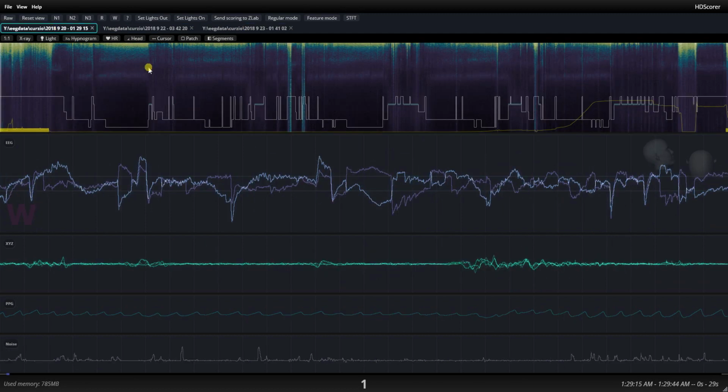I've got three different recordings here in front of me. These are for the past few nights, and it's my EEG. September 20th, 22nd, and 23rd, because on the 21st I forgot to push store, so I went to bed with Zmax and it didn't record anything. That's better, learn how to use my own software here.